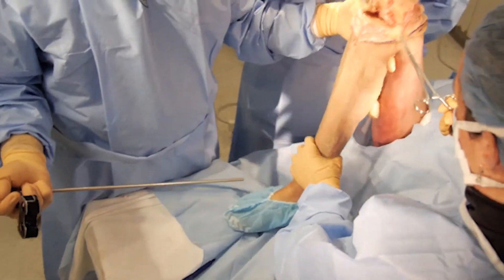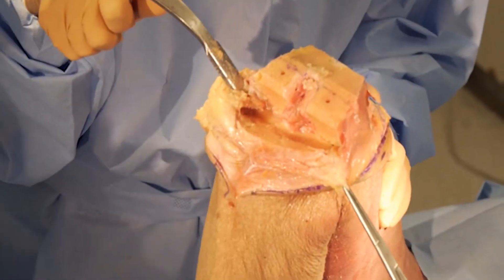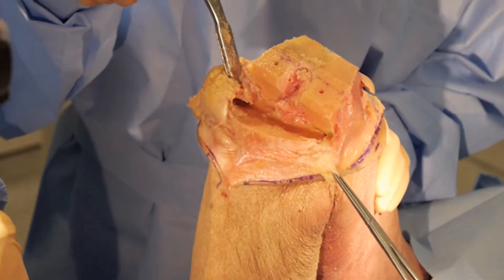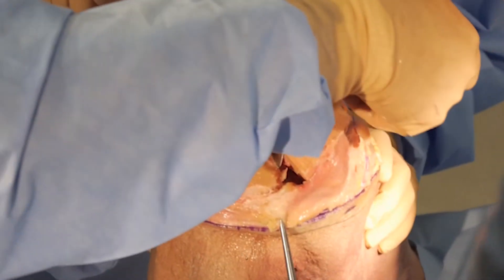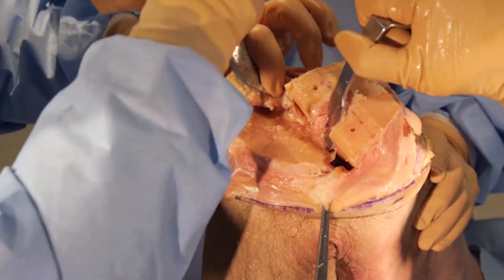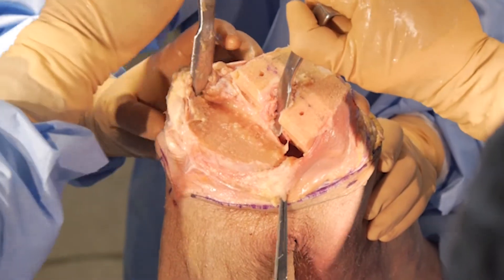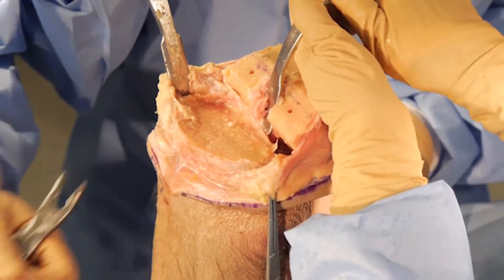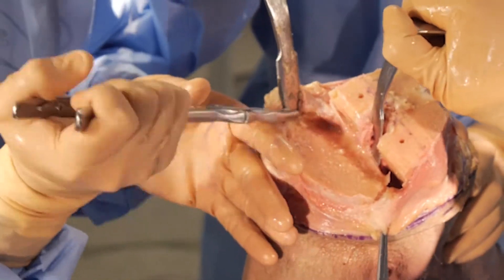Now I'm moving on to the tibia — sizing the tibia and preparing the proximal tibia. I can take a thin bent Hohmann retractor around the back of the knee to really sublux the tibial plateau, which gives me the best sizing. I'll move this retractor so I can see laterally, and at this point use a curette or rongeur to clean up any bone remaining on the lateral side of the knee.